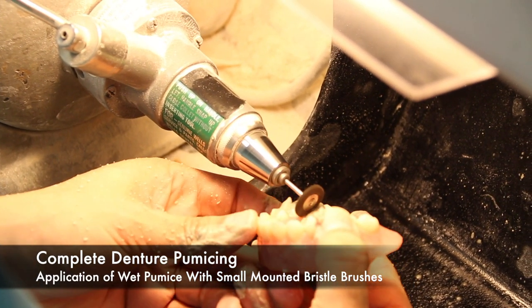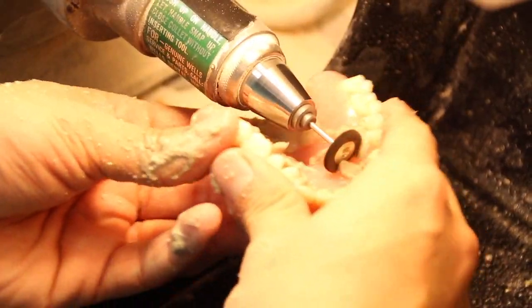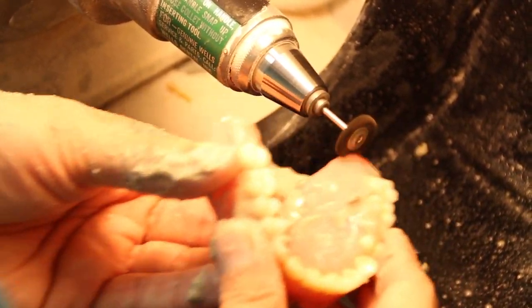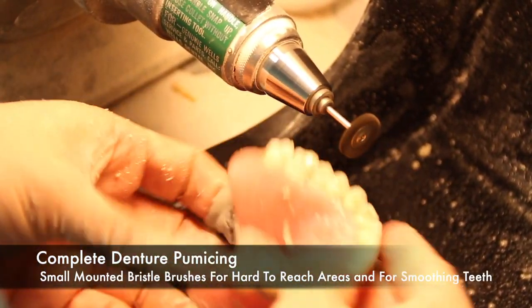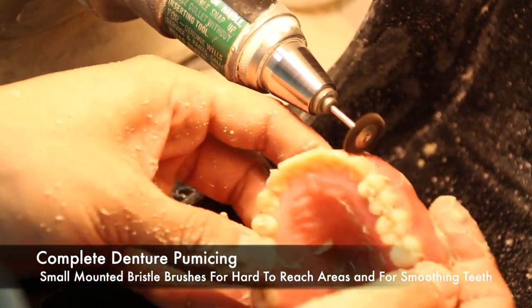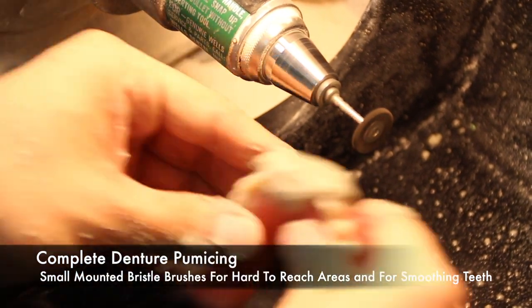When pumicing, you can make use of small mounted bristle brushes as well. These are great for getting into hard-to-reach areas. They also allow you to apply pumice to selectively ground teeth to smooth the ground areas, and they are great for reaching in between interproximal areas and smoothing the gingival margins.